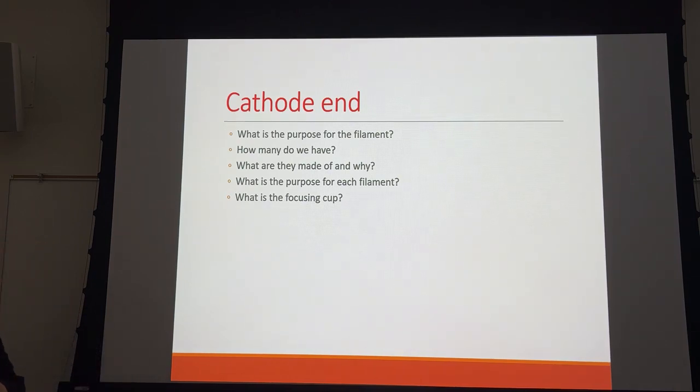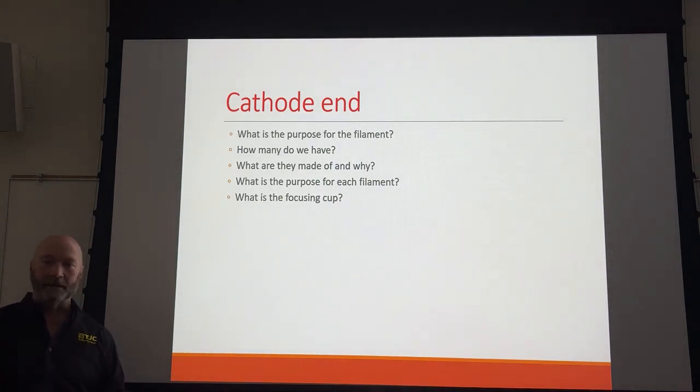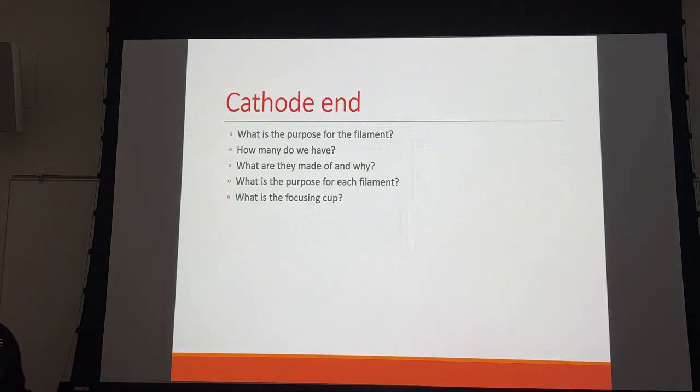Select the small focal spot and then select 400 mA and see what happens. Unless you're working on some weird equipment, it's going to give you tube overload. At any mAs value, it's not going to let you shoot with 400 mA. As protection, it doesn't want to stack that many electrons on a small focal spot size. Click it over to large focal spot and you can shoot all day long, okay?